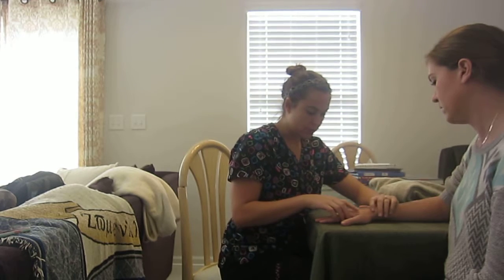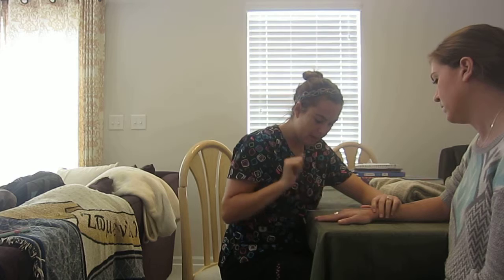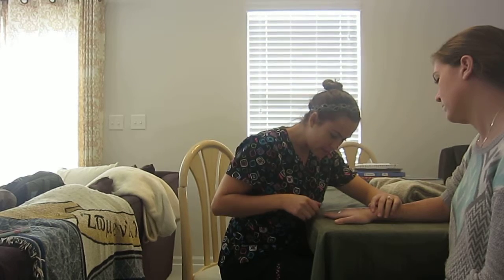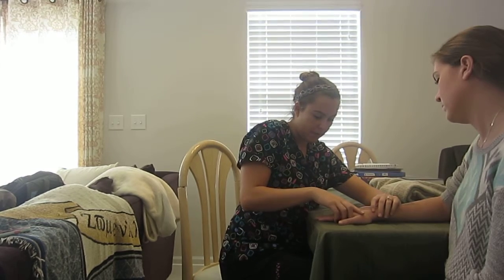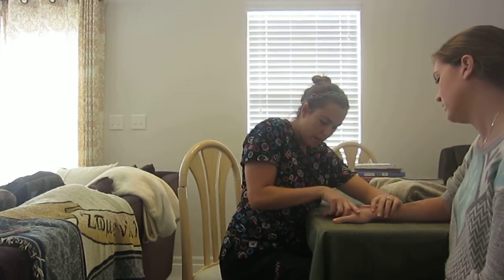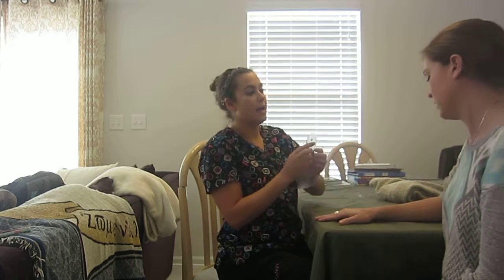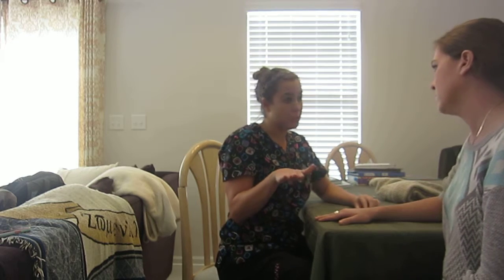And then we're going to do this one more time towards your pinky side. So go ahead. And I'm getting 38 degrees. And then if I were to do it passively, on your middle finger, now I'm getting 40 degrees. And the norm for that is 30 degrees.